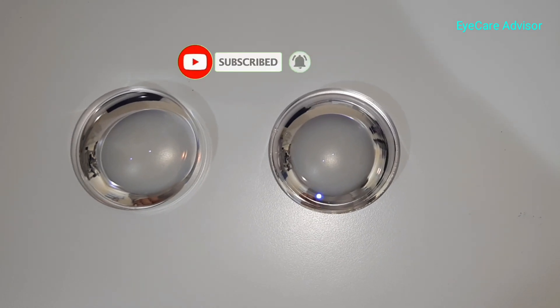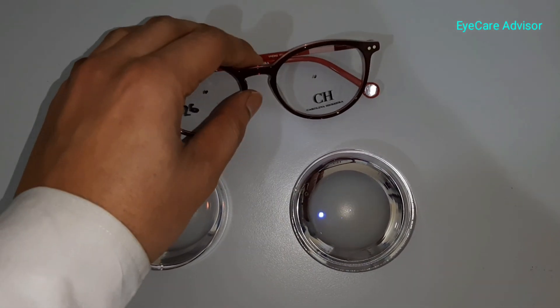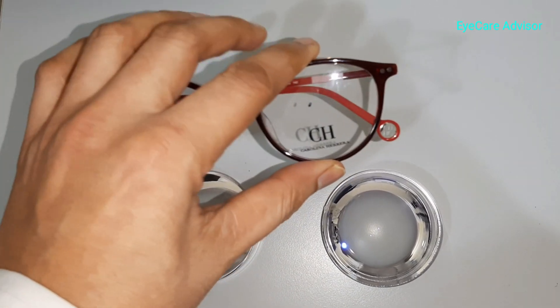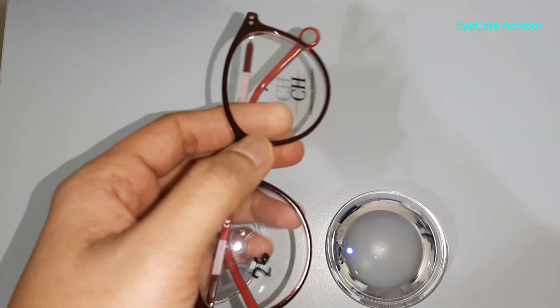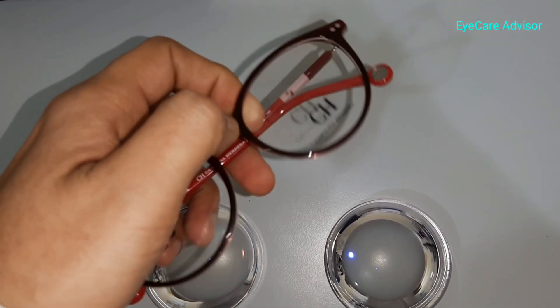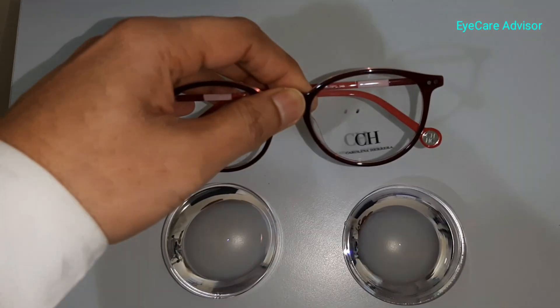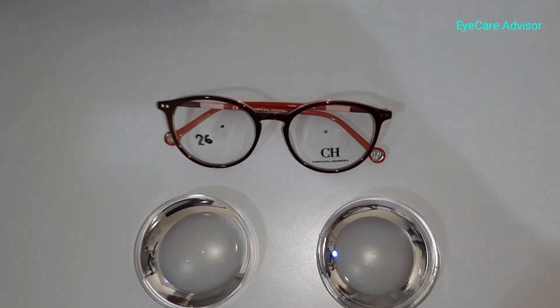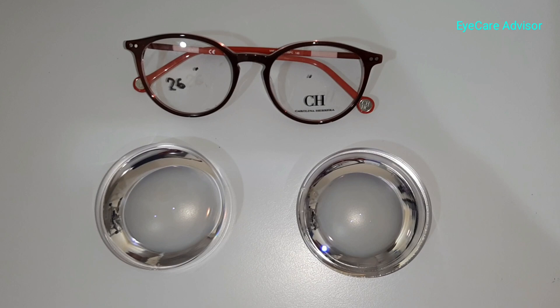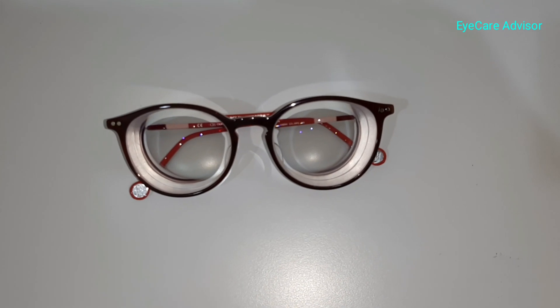Now I will show you the frame on which we will be putting the lenses. This is the frame chosen — it's a little bit bigger in size. Generally we recommend smaller size frames, but the person who bought this wanted to go for bigger lenses. This is a slightly roundish frame, so hopefully we will try to fix it well so the thickness shows minimally. Now we will fit the lens and come back to show you how it looks.